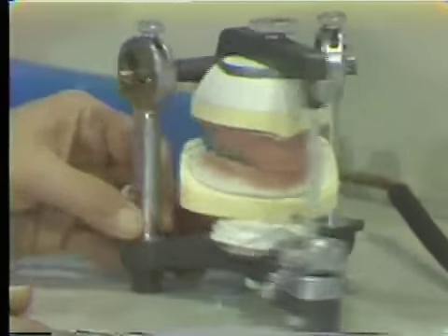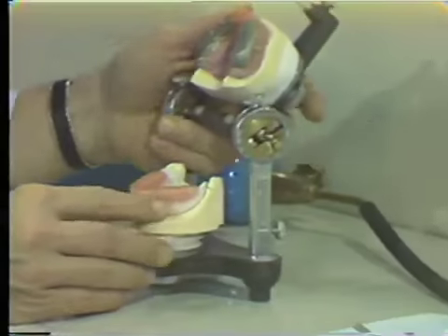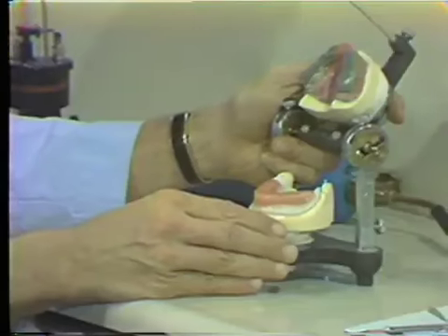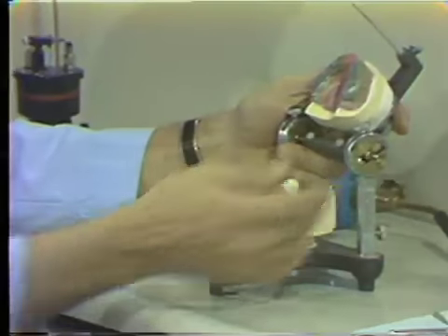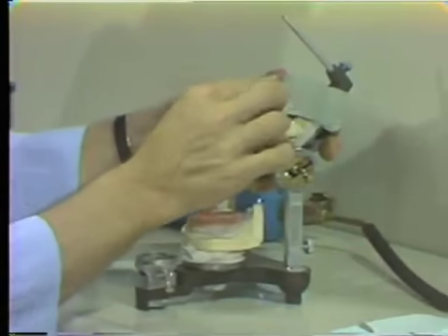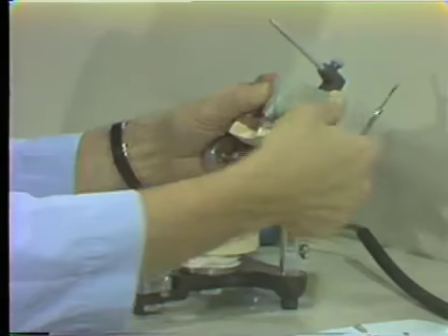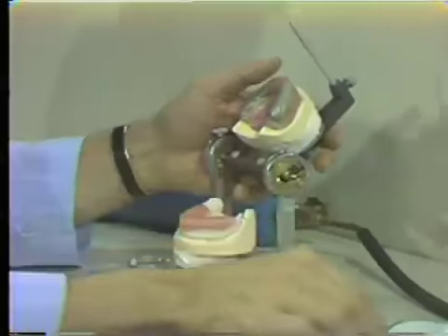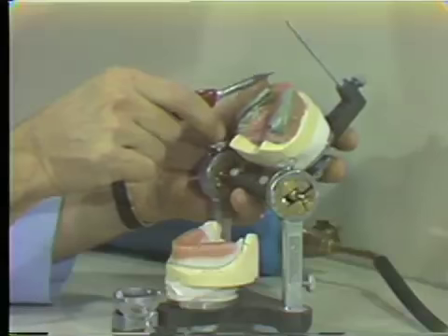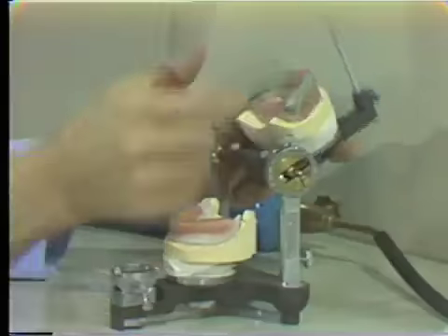Our next step then is to add more soft wax and return to the patient for the registration of a protrusive position so that we may set our condylar inclinations. We'll add just a little more wax each side, cut off the excess, add a little more on this side, and again we'll cut off the excess and soften this with our alcohol torch.